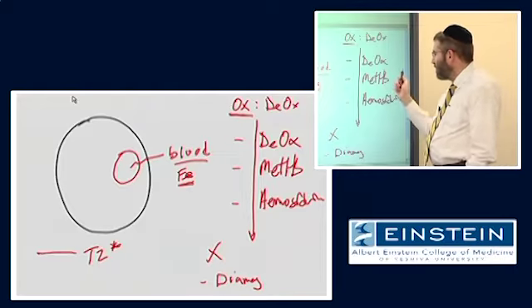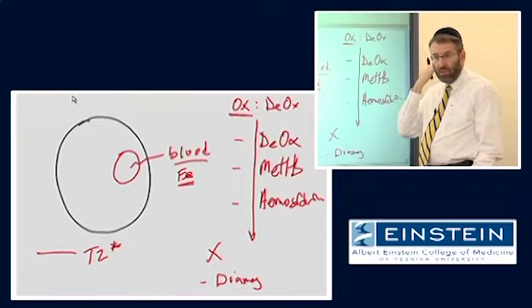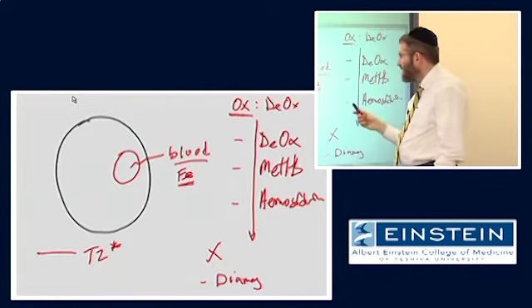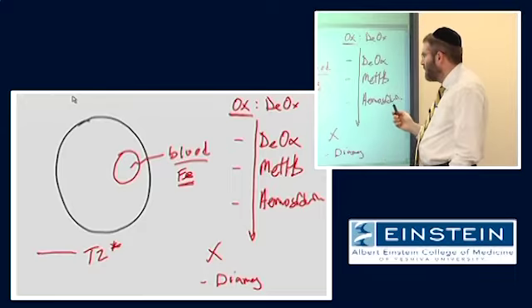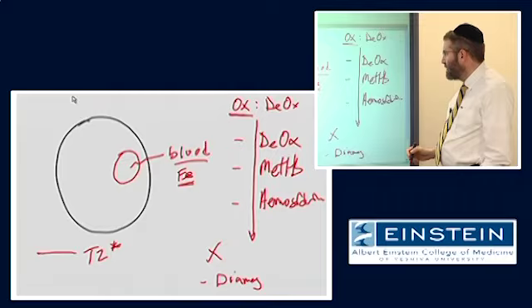Now, there's another phenomenon going on here which has something to do with the nature of hemoglobin, but is totally different than this bulk magnetic susceptibility effect.